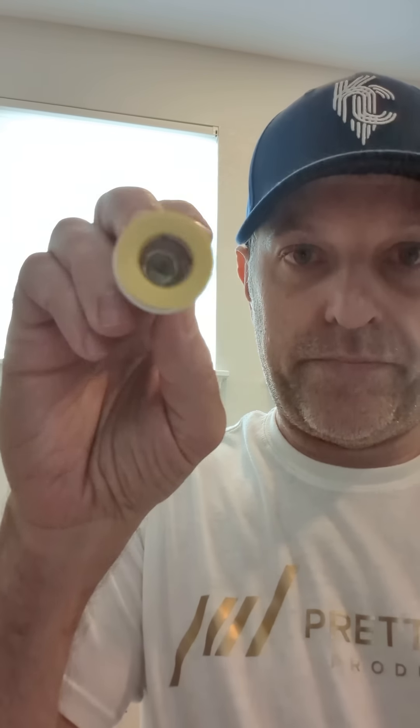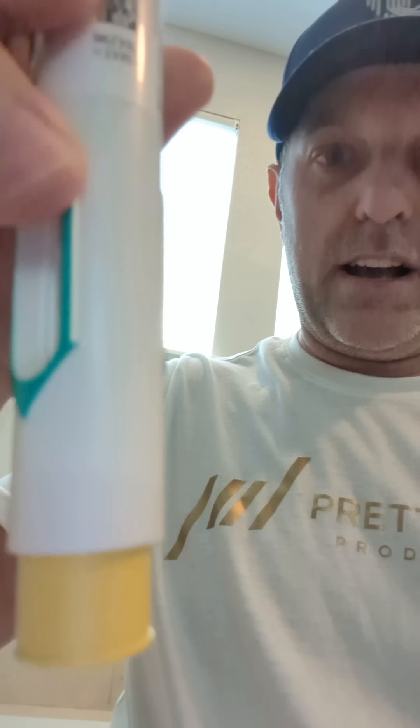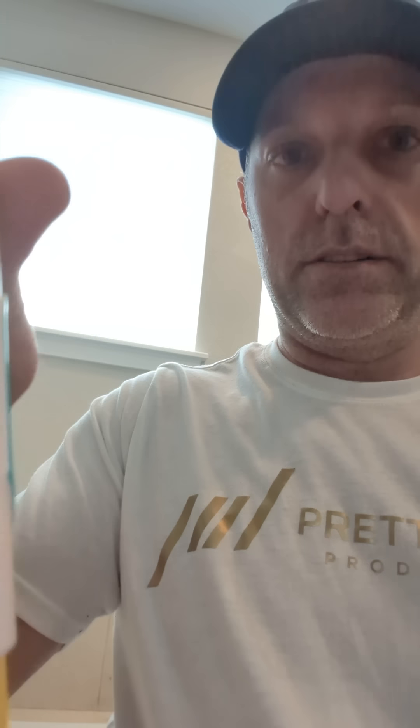So what you have is this medicine here and you can see it in the clear tube and there's a needle right in there. You plug this down, you push this down and the yellow is going to go up into the white and the needle is going to go in you. It takes about seven or eight seconds and it makes a click, and then you keep it in three seconds then you pull it out.